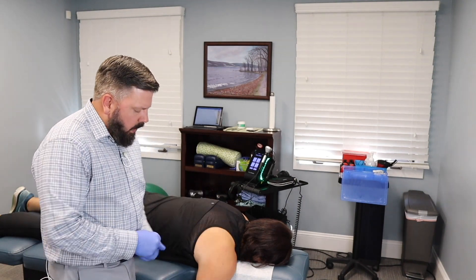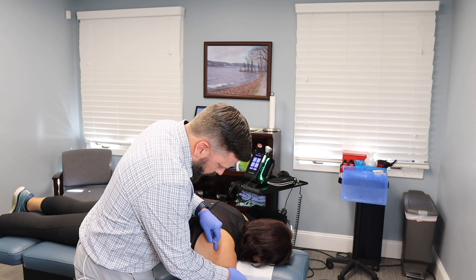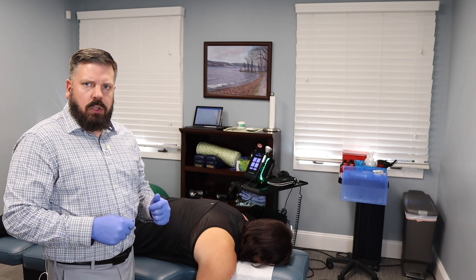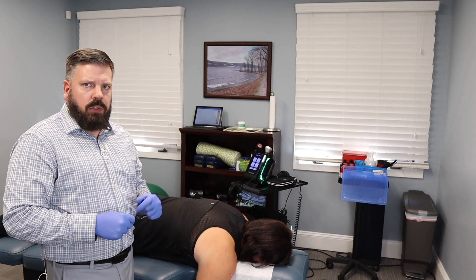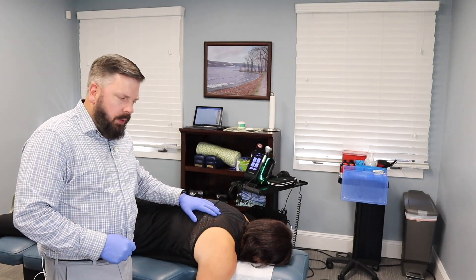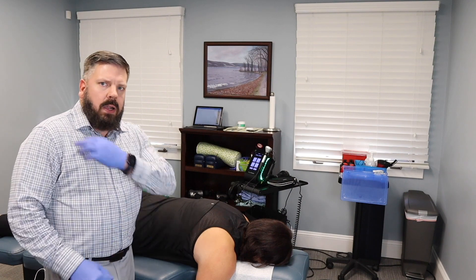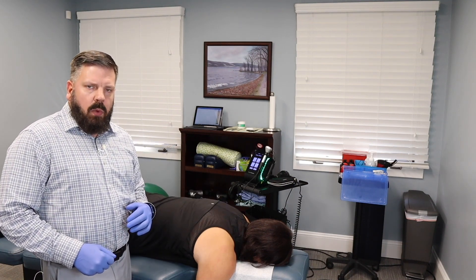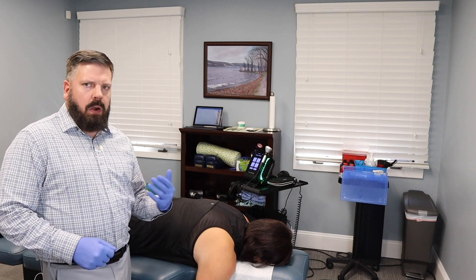We place needles in various areas throughout the rotator cuff. It's a very quick treatment — the needles are in for about a minute and come right out, as opposed to traditional acupuncture where they're left in for 15 to 20 minutes. We apply dry needling all the way around the back of the shoulder, sometimes into the scapular region, and also on the trapezius, because limited range of motion causes compensation and neck and shoulder tension. We also treat the front of the shoulder and the muscles in the axilla area that are part of the rotator cuff.